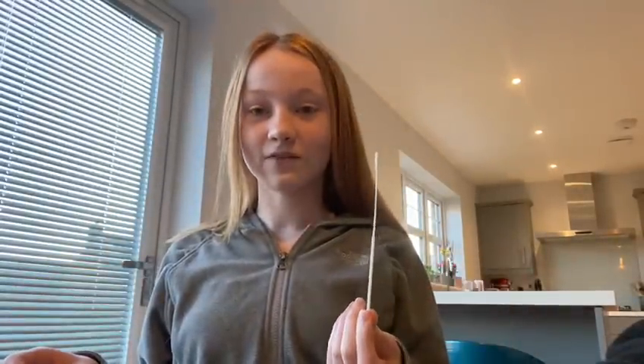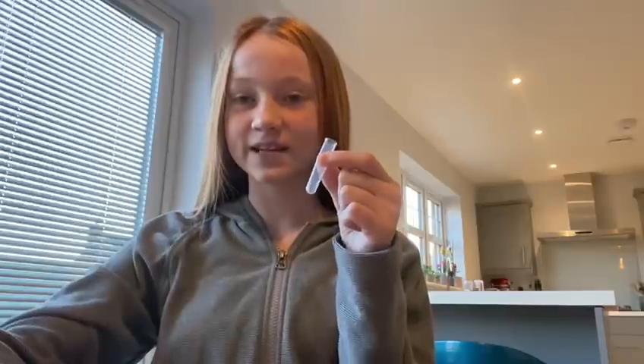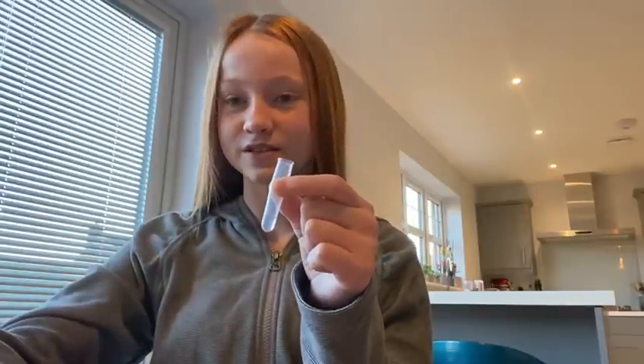When you take the swab out, be careful to only touch this end and not this end, where you're going to put it up your nose and in your mouth. I've put about six drops or so of the solution into this tube. Here it goes!